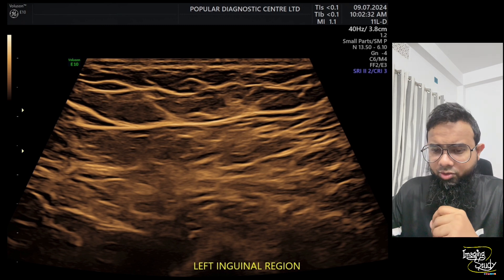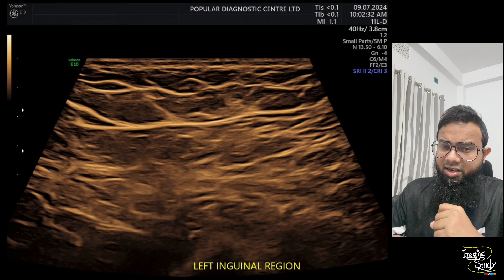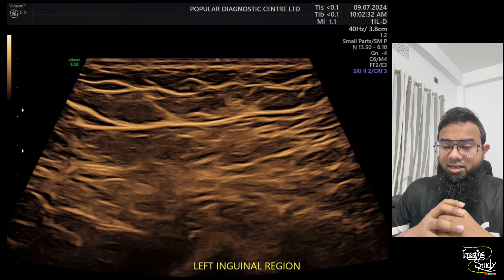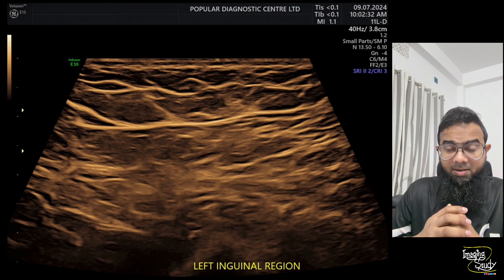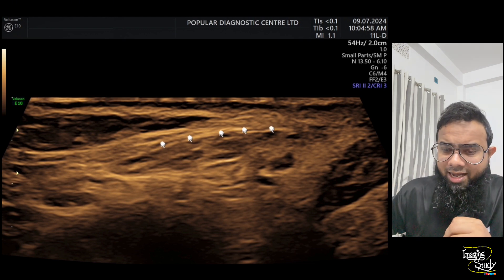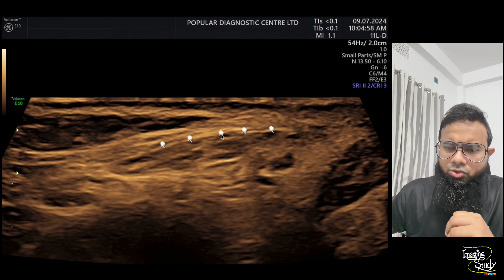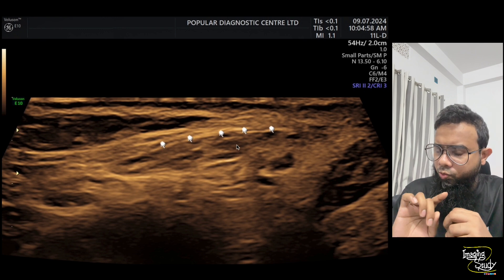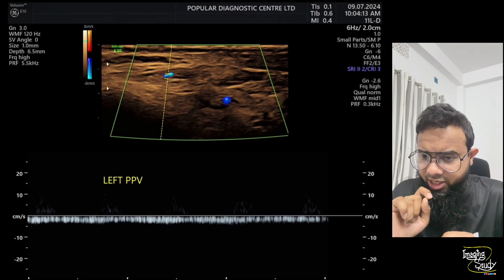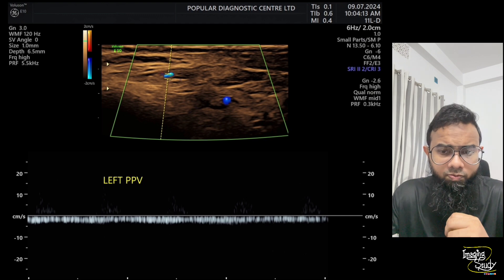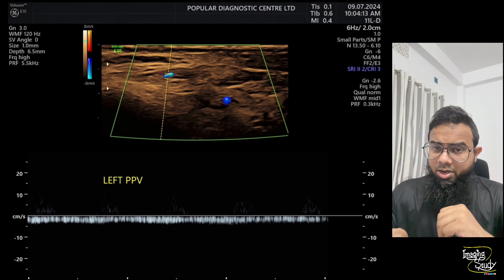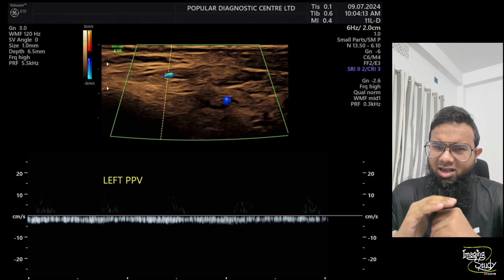Now let's look at the left inguinal region. As the patient says there is no left testes, I placed the transducer over the left inguinal region and there was no testes there — so it's not a straightforwardly undescended testes. However, I can see a cord-like appearance within the inguinal canal on the left side. This means there should be a testes present. On color Doppler I can see some venous flow — this is the pampiniform plexus — indicating the testes is located inferior to this point.